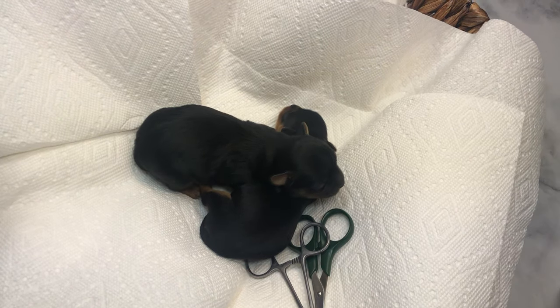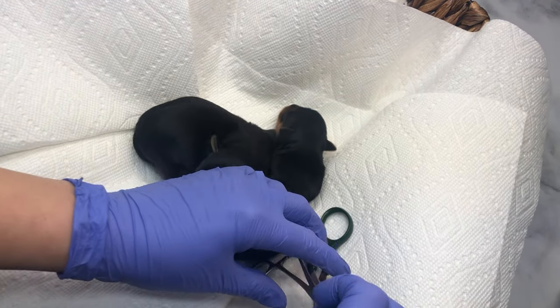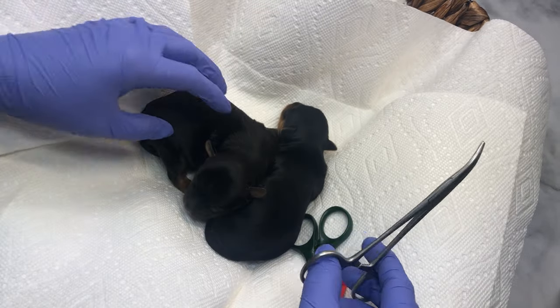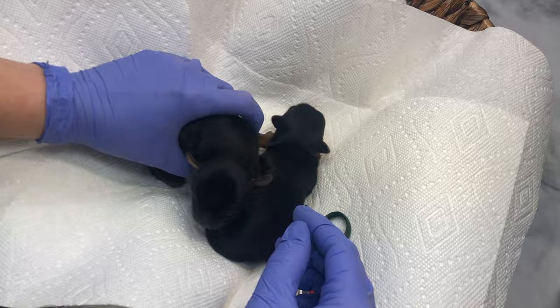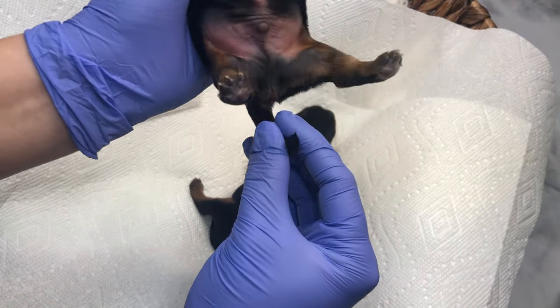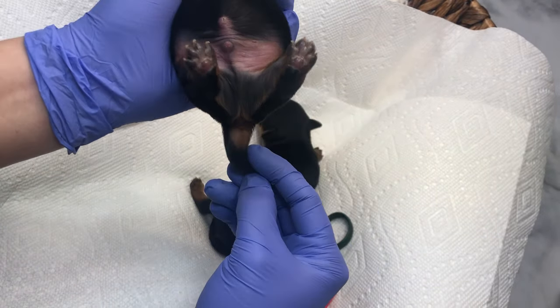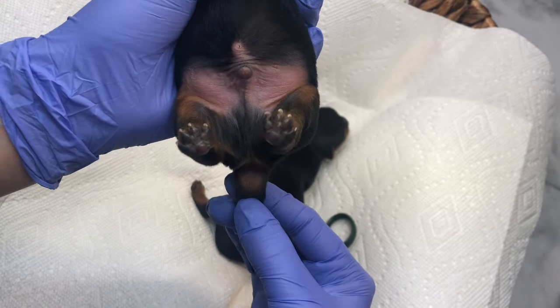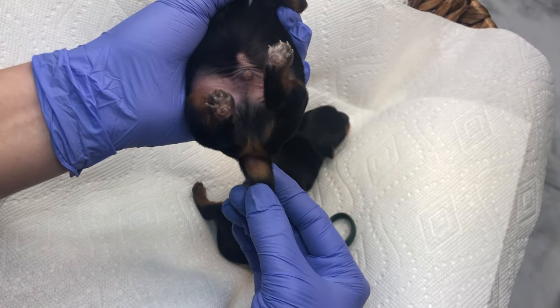The first method you can use to dock the tails is just using a clamp. How you decide where you're going to clamp — the standard for the Yorkshire Terrier is right where the tan spot ends. So you're going to clamp right there.